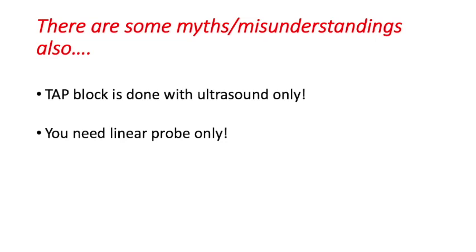Second biggest myth is you need a linear probe to give tap block. Yes, usually it is given with linear probe only because it is a bit superficial block. In obese patients, sometimes you require a curvilinear probe. Otherwise, in more than 90% of the patients, you can give it with a linear probe with some application of pressure. But even if you don't have a linear probe, and if you have a curvilinear probe or transvaginal probe, you can use it to give tap block, and I will show you how to do it.